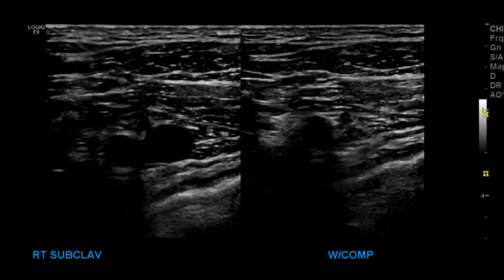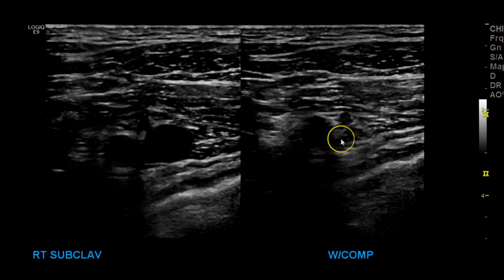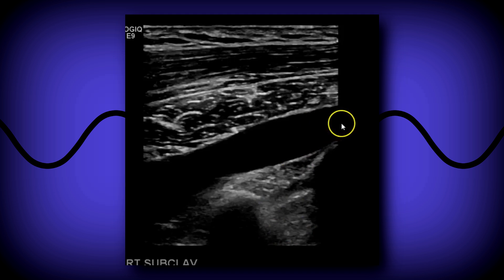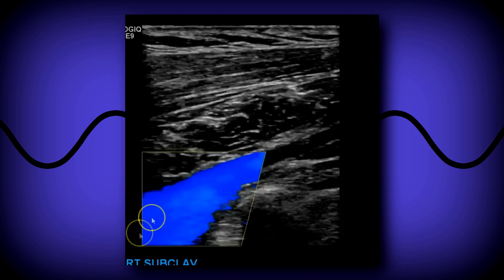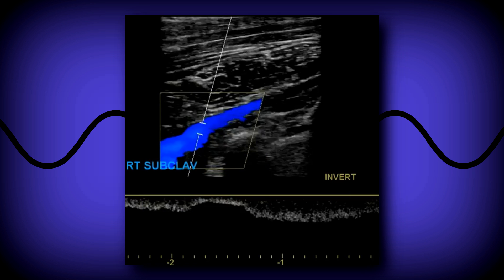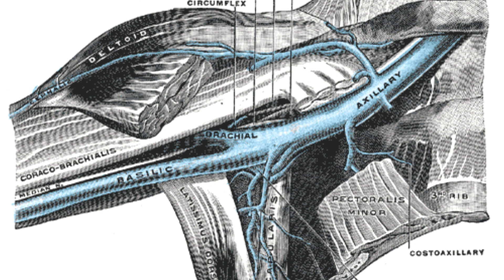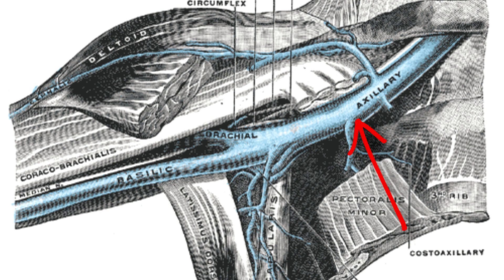Here you can see respiratory variation in the longitudinal subclavian vessels. In the transverse view of the subclavian vessels you see the vein and artery, then a collapsed view, then a nice clear grayscale image showing the vessel wall, and then with color you see the respiratory variation of the Doppler waveform.